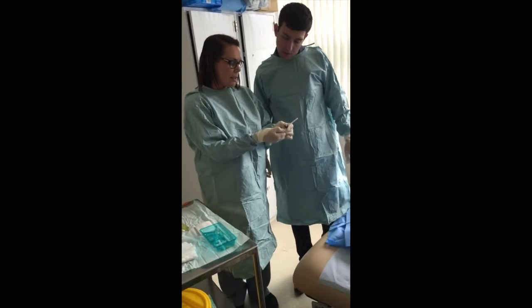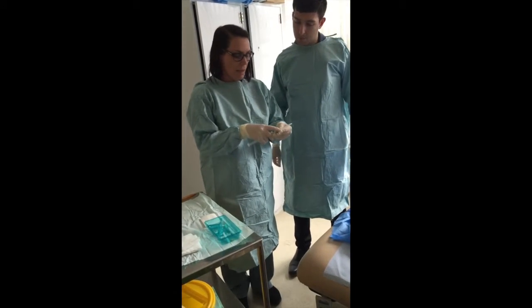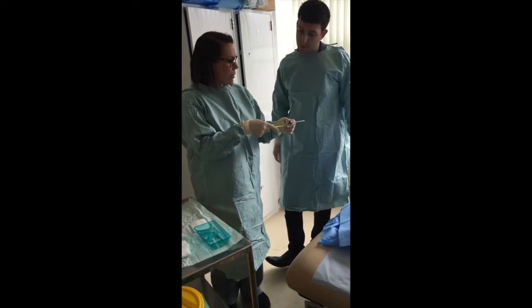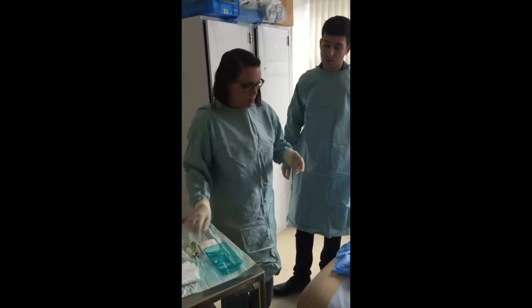So you basically take the two ends of the cannula off here, put your syringe onto the end of it. You don't need to put the syringe onto the end of this, but what you don't get with this is you don't get a flashback like you would with blood. So that's all ready to use in the procedure.